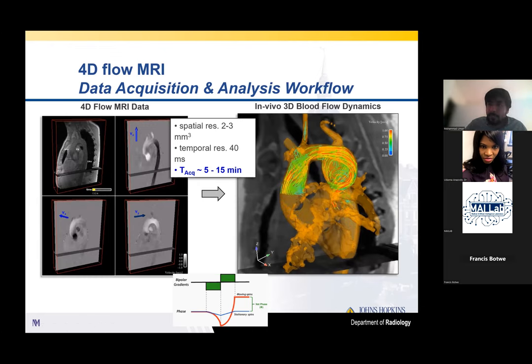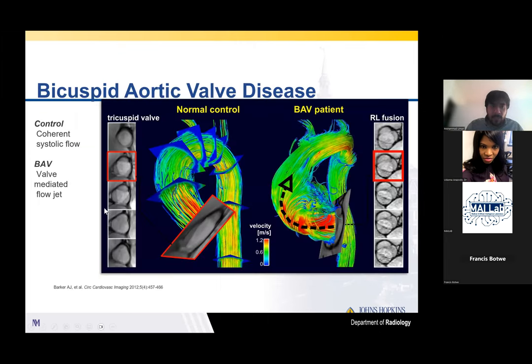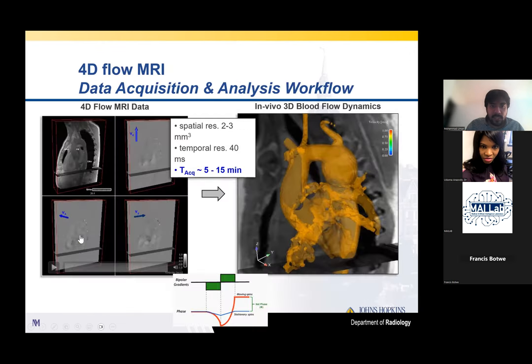Here, on the left, you see a regular 4D flow acquisition of the chest. You see that the flow in all these different chambers can easily be seen, and you can set different planes, including off-axis planes. All the data for all the quantitative assessments of flow dynamics in the chest for that one cardiac cycle exists there. It's not that you only set the plane on the aortic valve and only get aortic valve quantification. You can troubleshoot.